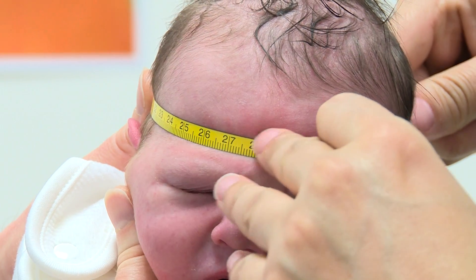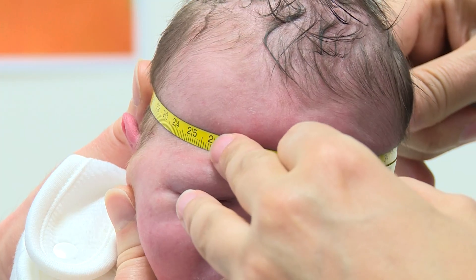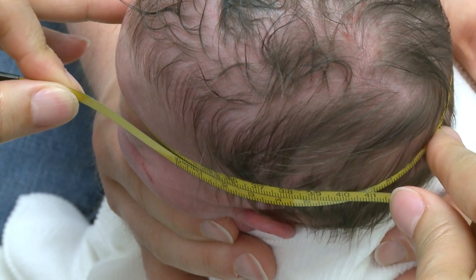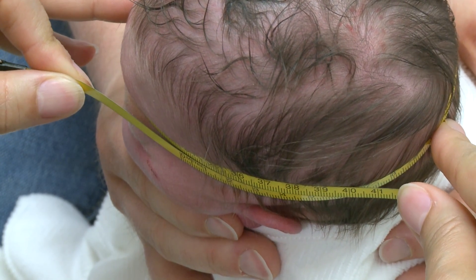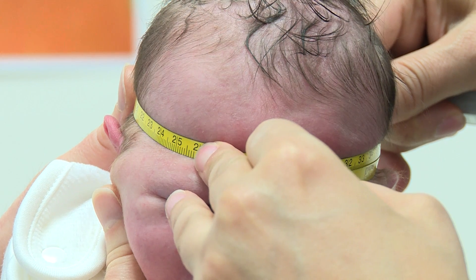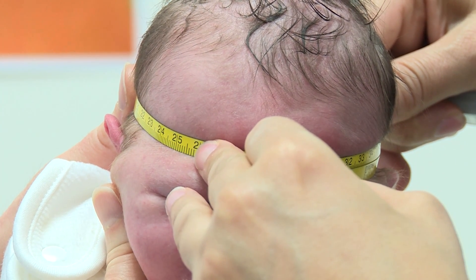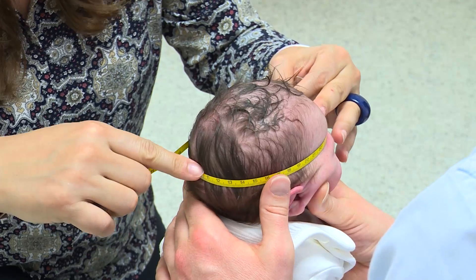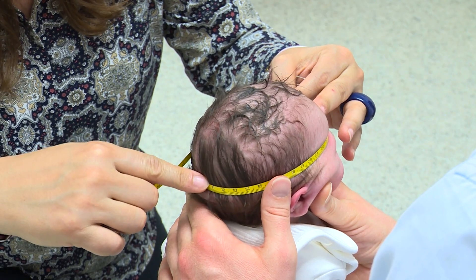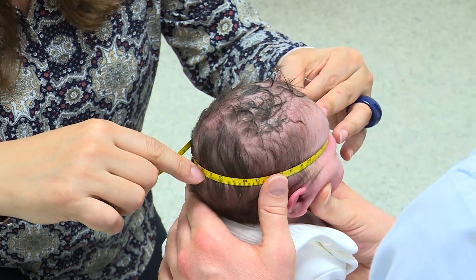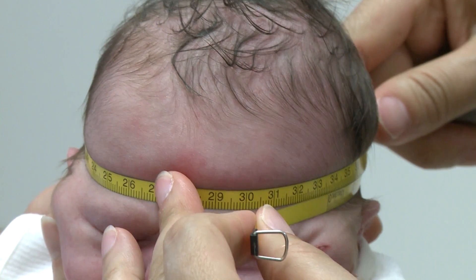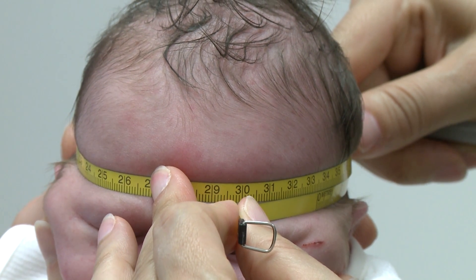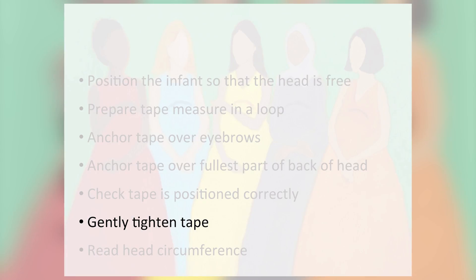To ensure the tape is stable, the measurer can anchor it at the front and the back of the head using the middle finger of each hand. Once the tape is in the correct position, the measurer gently tightens the tape to compress any hair and fat. In newborns, a great deal of care should be taken not to tighten the tape too much.